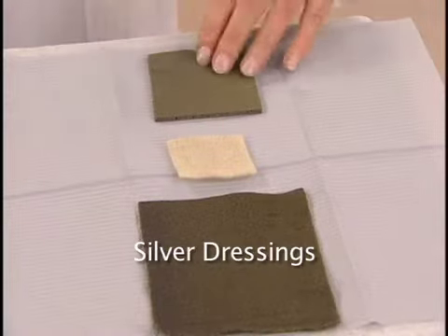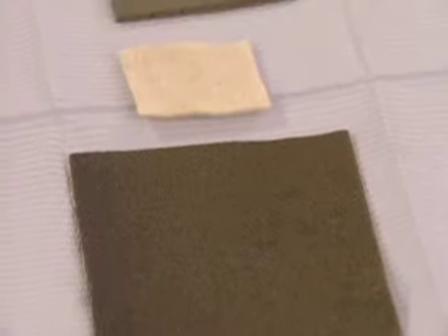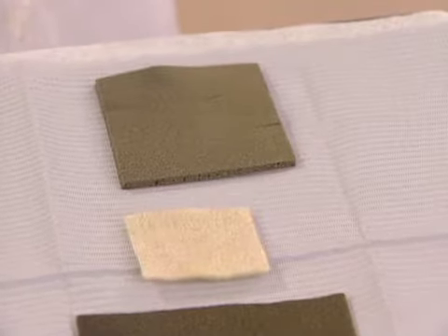These dressings contain broad-spectrum antimicrobial agents and have been developed to minimize colonization and prevent local infection, thereby promoting wound healing. Let's now look at a number of antimicrobial dressings. Silver dressings. Silver has been known for centuries to have antimicrobial properties. There is currently an abundance of dressings on the market that deliver ionic silver. Some of these dressings appear to be particularly effective at eliminating antibiotic-resistant bacteria, such as MRSA and VRE.